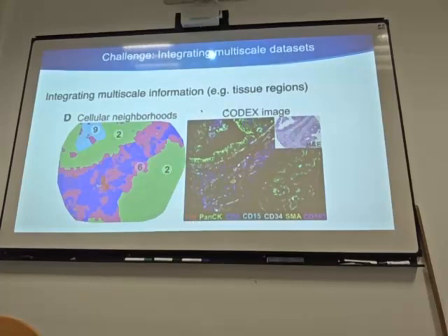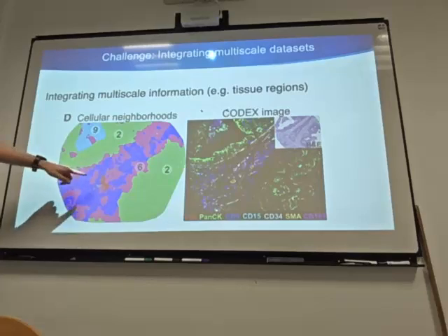So for doing the classification and to predict, for example, the survival of a patient, it becomes increasingly clear that you need the local association, but also the semi-local association, for example, what is the relation between this neighborhood and another, and how you define this neighborhood is not clear.